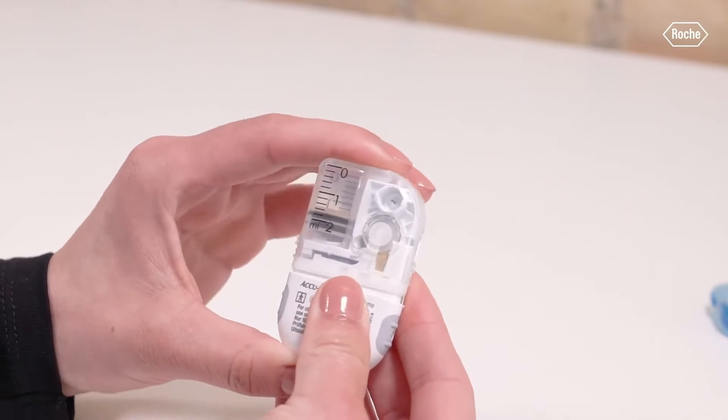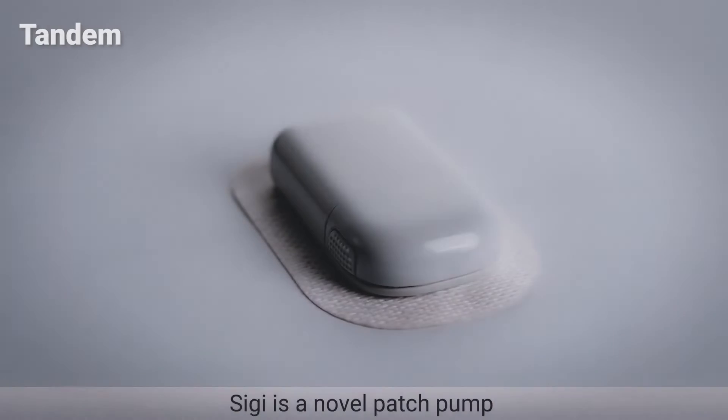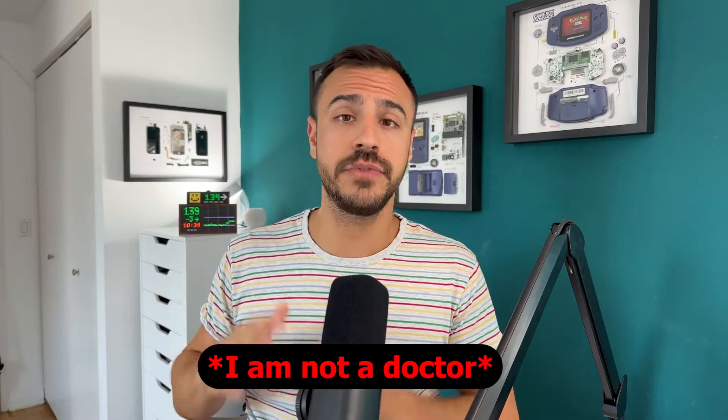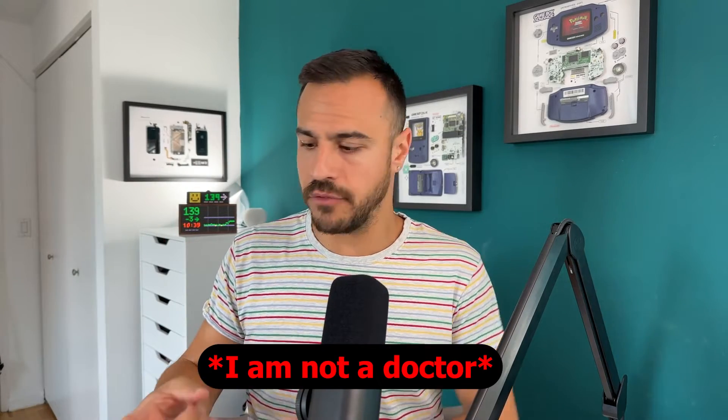I've already spoken about Medtronic's new Eoflow and Tandem's Sigi tubeless pump — if you want to learn more about those, I've got videos on this channel. The Accu-Chek Solo is for those who are two years and older, and there is so much to cover: which parts are reusable, which are disposable, how it works, its quick bolus buttons right on the device, and so much more.